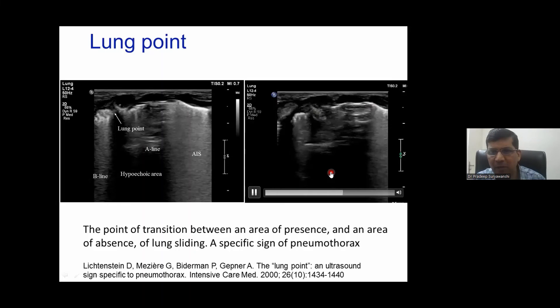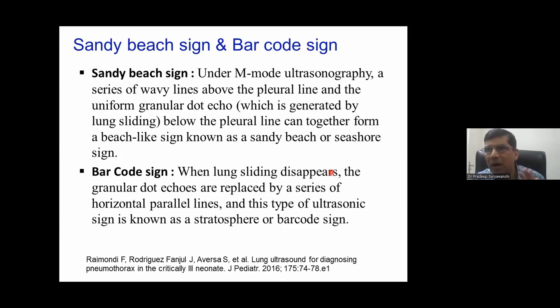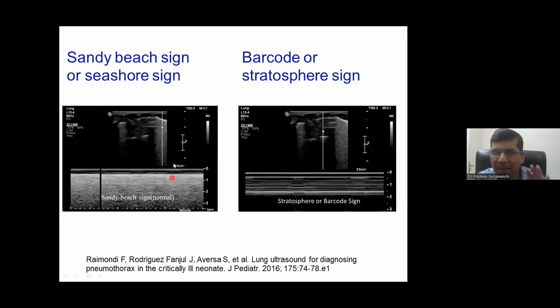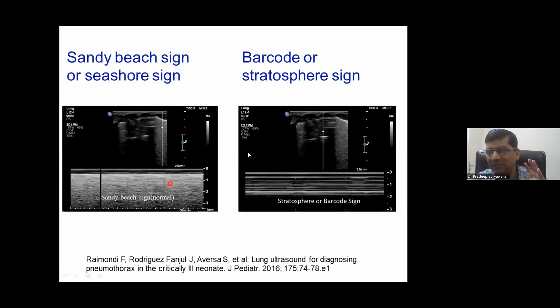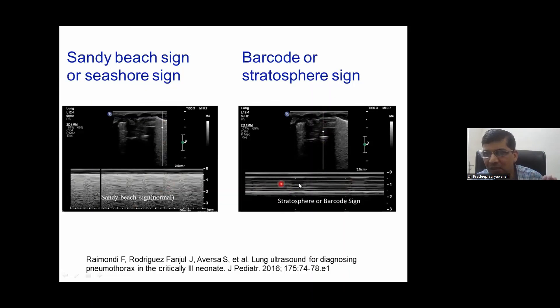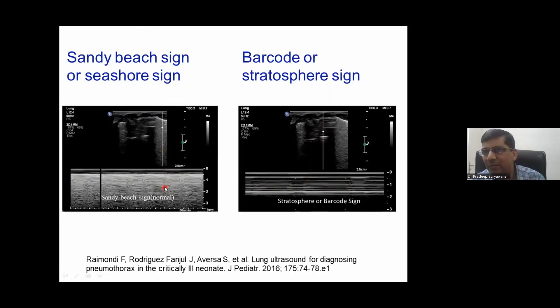One more point about M-mode: when M-mode is applied to a normal lung, it looks like a sand and beach pattern. When M-mode is applied to a lung with absent sliding, it looks like a barcode sign. The barcode sign is one more pathognomonic feature of pneumothorax. The sand and beach pattern is normal because we can see air movement; with no sliding, we get the total barcode sign.